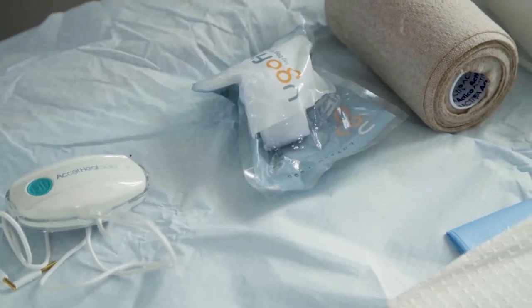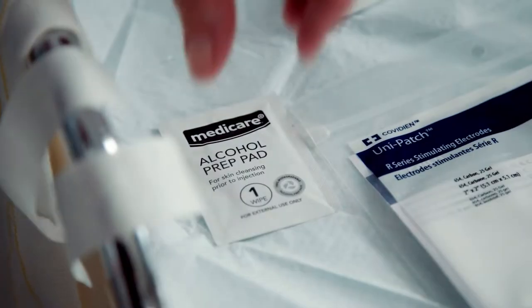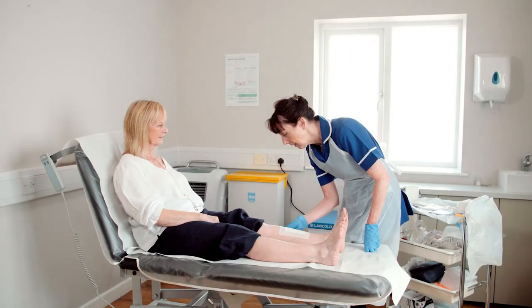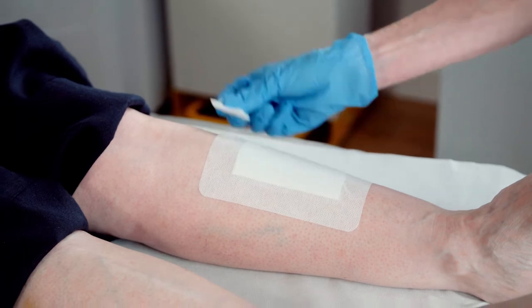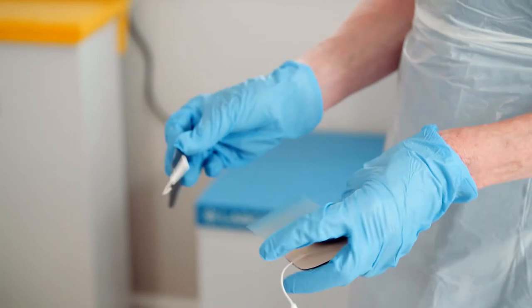Prior to applying Axel Heal's electrode pad, ensure any excessive dry skin is removed and avoid using emollients. The selected area needs to be cleaned with the wipes provided within the treatment pack. This preparation will ensure a good adhesion of the electrode pads.